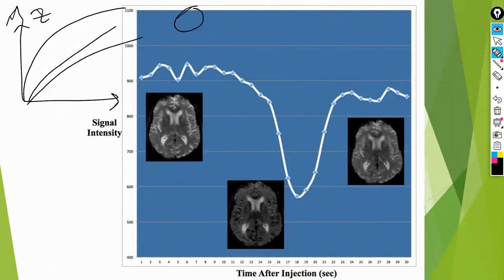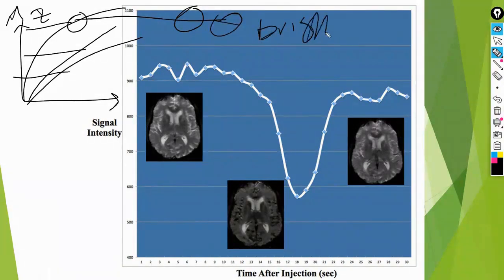You stand here to record which one has the highest signal, which one has the highest brightness, where the tumor is, right? The tumor will be more bright. So we understand the brightness game. You are standing to record. This contrast agent made it fast because it has the contrast agent returning, so it became high. When you come to record, yours is very high, the highest one compared to the surrounding tissues.